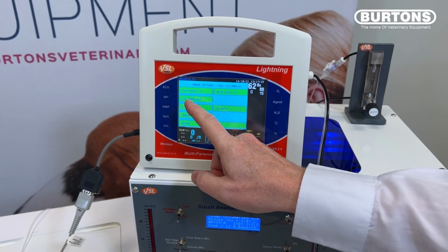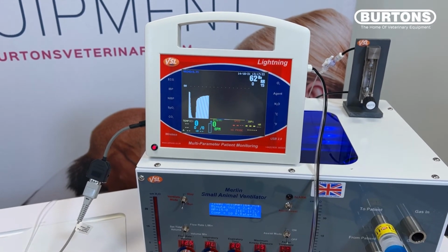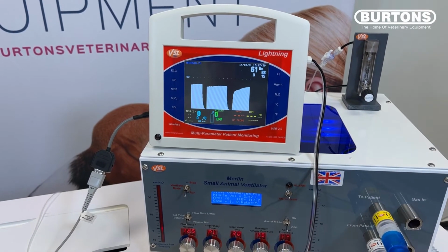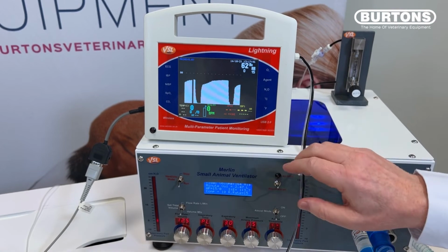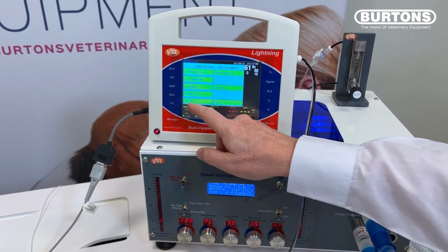If I turn the color capnography mode off, like that, we're back to where we were before, and as I say, it looks like a very normal, respectable outline of the trace. We've got a normal phase 2, phase 3 and phase 0. That's quite normal and quite acceptable. The only thing wrong with this picture is perhaps the high end tidal value. Put the color-coded capnography back on.